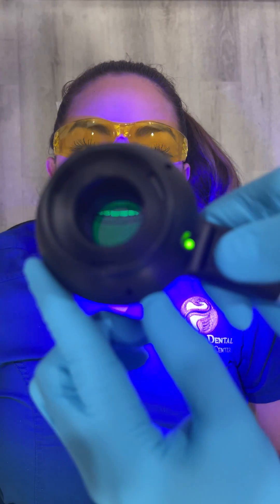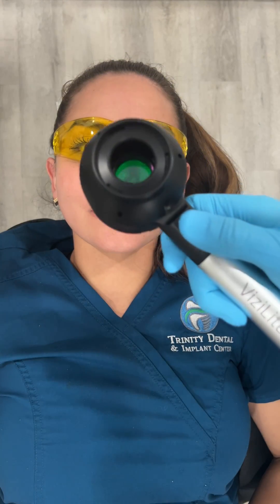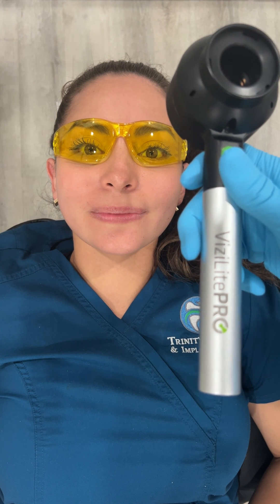So our patient is now ready to go. This concludes our examination. And with this, we can be sure that the patient is nice and healthy, and that can save the patient's life.